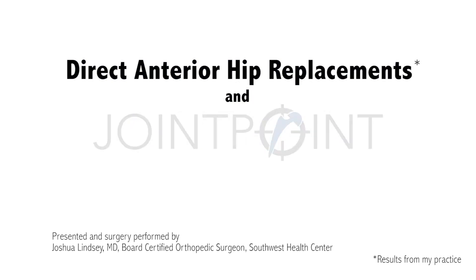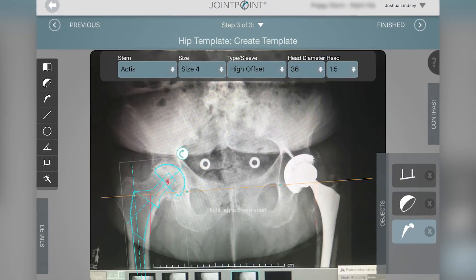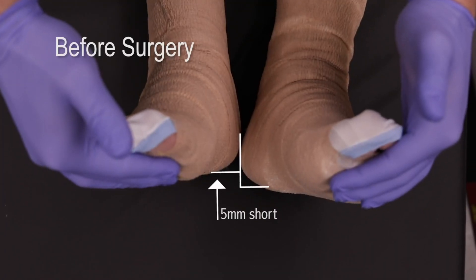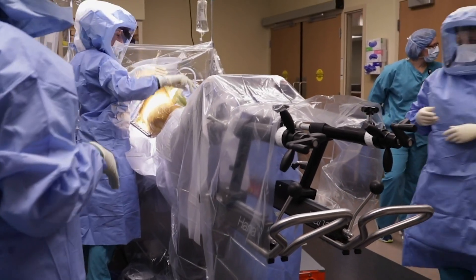Anterior hip replacements using Velys hip navigation: an abbreviated technique. The first step to every successful hip replacement is preoperative templating and assessing for a patient's leg length inequality prior to surgery.